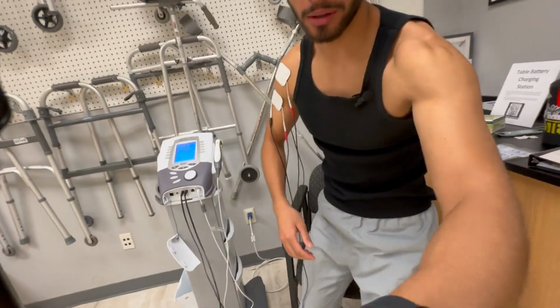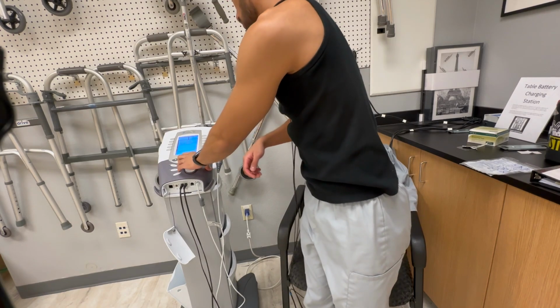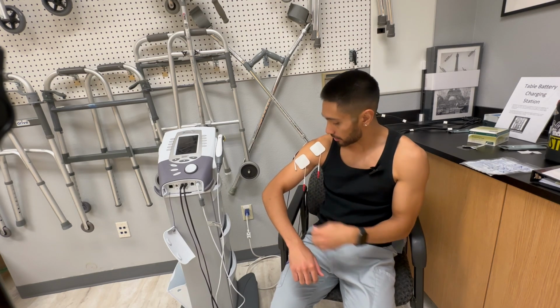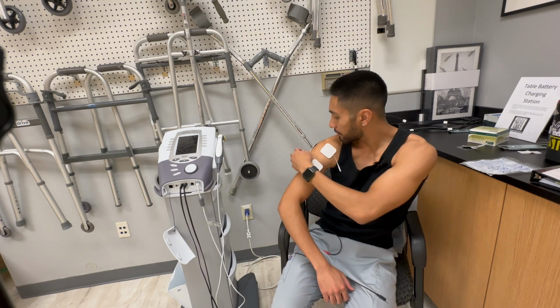So now that that is complete, we can go ahead and stop treatment. Go home, turn off the device. Now we can safely unplug the connecting pads from our electropads' connecting wires.